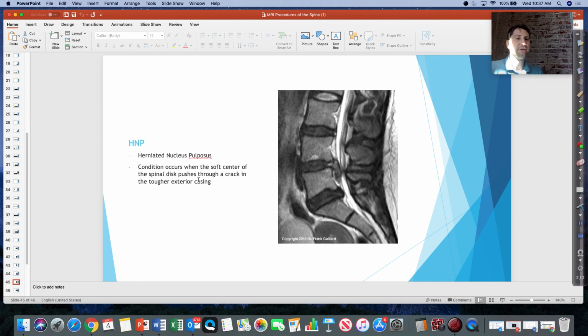And then our herniated nucleus pulposus, most common. Here the herniation is not only going posterior, but it's going inferior. So it's now herniated back and down. So this is why when you do those individual slices, you need to make sure you cover the whole pathology. So don't just get 3 slices, one on top, one through the disc space, and one on bottom, because you might miss some of the pathology. So make sure you do almost a small stack right here to get the entire pathology.